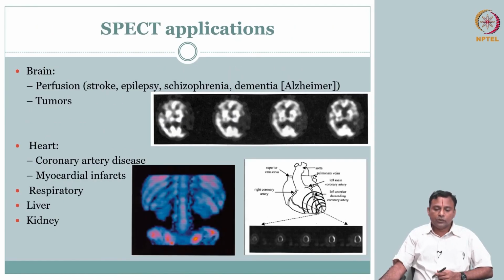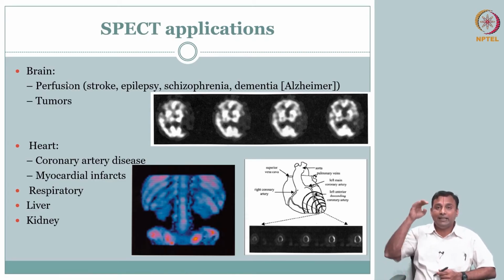Okay. So, there are several applications for SPECT. Brain, again brain is an active organ where we always talk about cardio, but then brain is very important opportunity because CT, remember CT, it is in the skull, you have to go through the skull, that way CT got popularity. Projection radiography, especially for brain soft tissue, was a challenge because your skull would take all the pixels. So, CT was very powerful to start to see inside the brain, but that is structural. So, we want to see the activity as well.